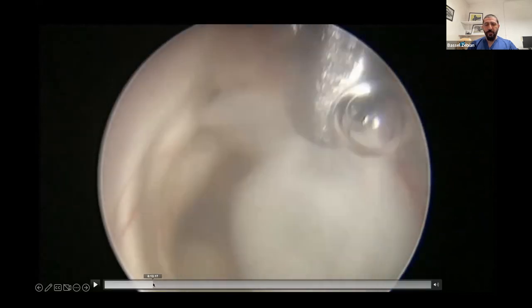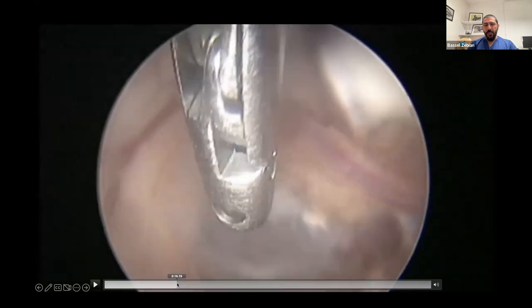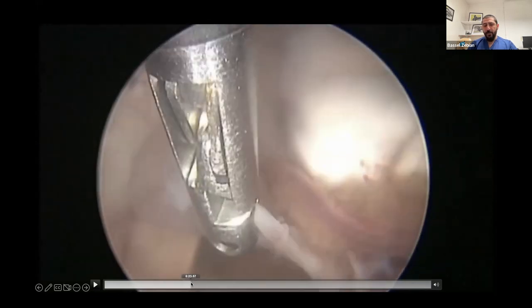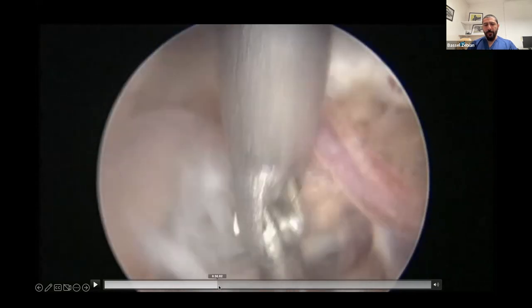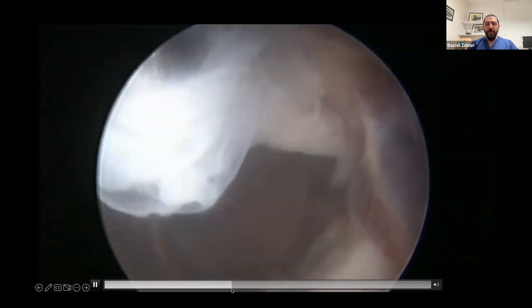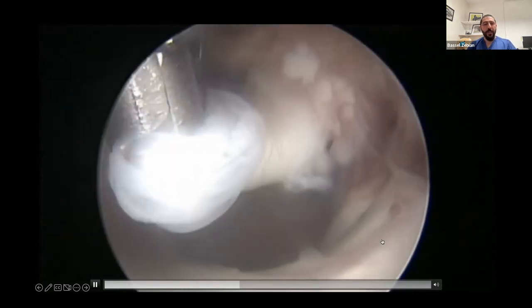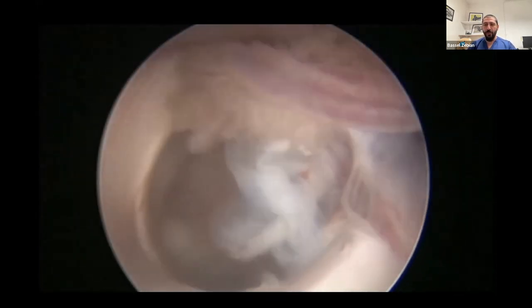Just because we're not really going to talk about colloid cysts too much, I will speed through it a little. And you can see we just suck in the capsule there. We're removing the capsule as well. And you often can twist. You've got to be careful how much to pull, of course, because you could be pulling a lot of the veins inside. So, a twisting motion: some people called it after themselves with their surnames, other people called it the spaghetti move and so on and so forth.